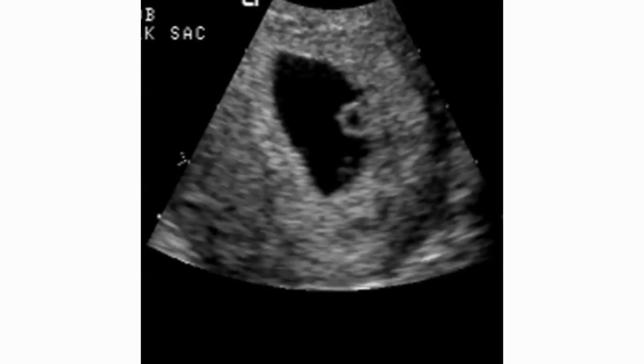This is a picture of a yolk sac. So you can see that gestational sac with that hyperechoic, or echogenic, I should say, rim, and the yolk sac within it, off to the side, not right in the center. So if you see this, you're good. You can stop unless there's a history of in vitro fertilization, IVF, fertility treatments, things like that, and we'll talk about that.